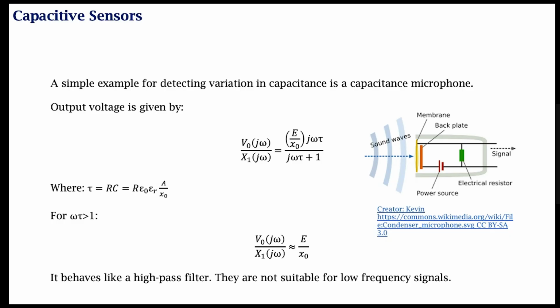And this would be extremely useful during situations like COVID, when the doctor has to be away from the patient, but still the doctor has to listen to the patient's heart sound. A wireless device. The patient keeps the stethoscope on his or her own chest, and the doctor listens to the heart sounds in her own phone, for example. That would be a fantastic application of device.